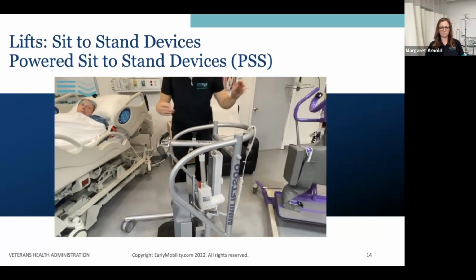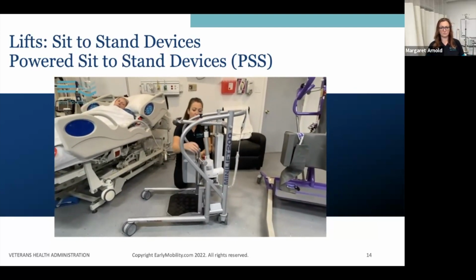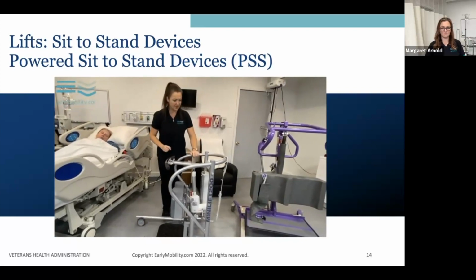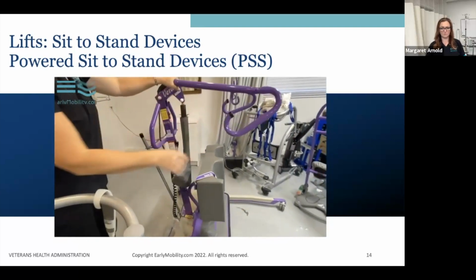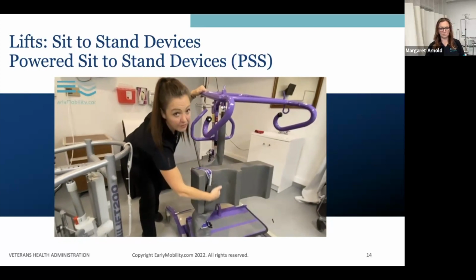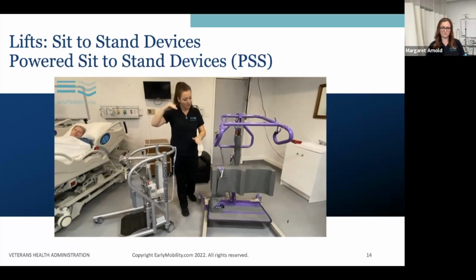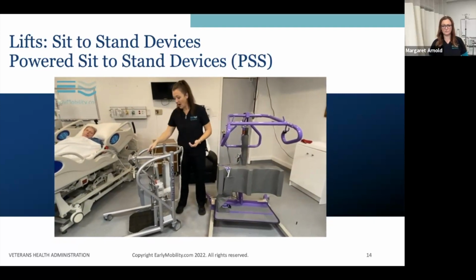In this one, the knee support goes down, goes up, so that you can attach it right at the level below the kneecap on your patients. In the van care model, it does not go up and down. It's fixed, but you'll see it's a lot deeper from top to bottom. That enables you to accommodate a wide range of patient heights. So some manufacturers make a deeper knee support, others make it mobile.